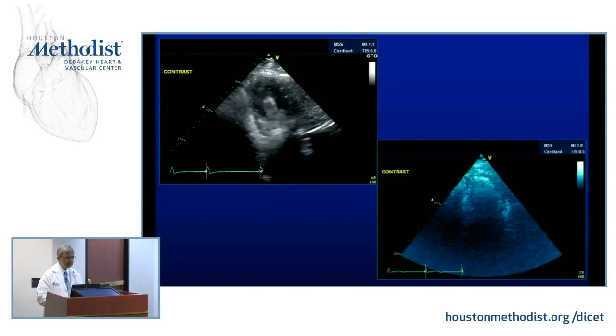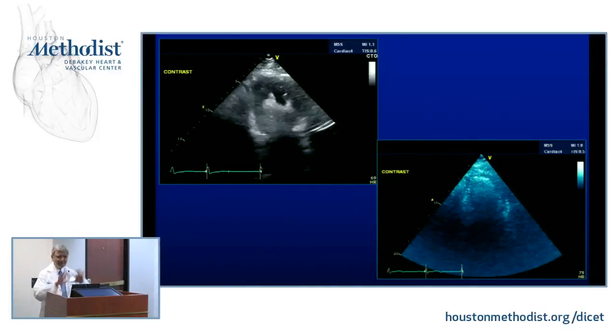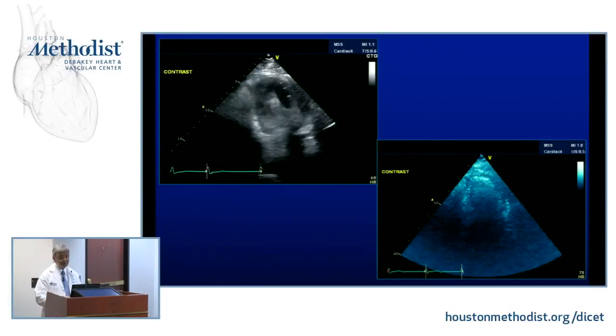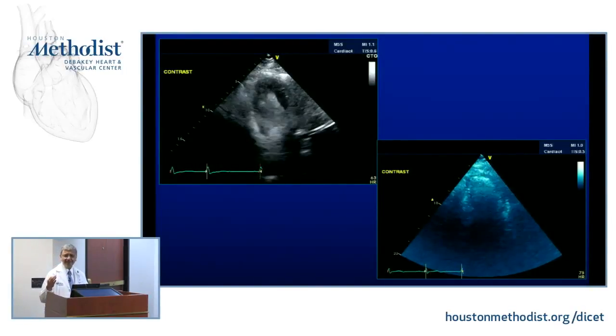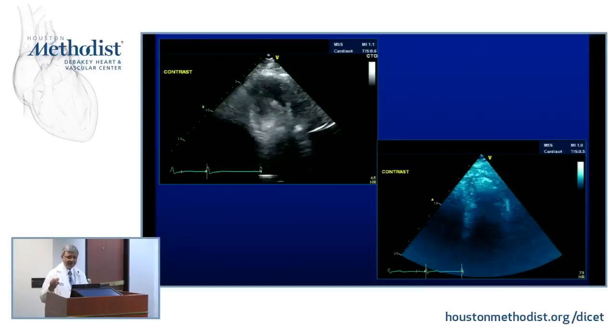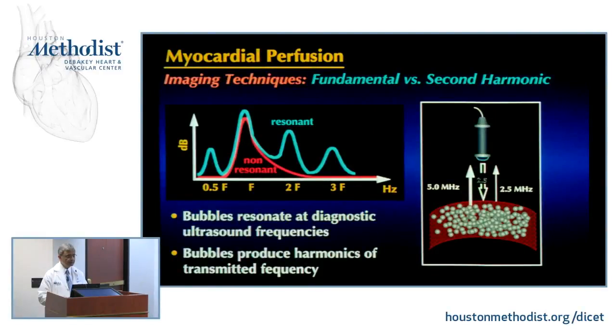And interestingly enough, what do I have down here? I have attenuation. So, you know, different mechanisms here of contrast, and the image is not good. So at least from a sonographer's point of view, if the image is not good, understand why it is not good. Is my mechanical index not set right? That's going to be very important for you to address.